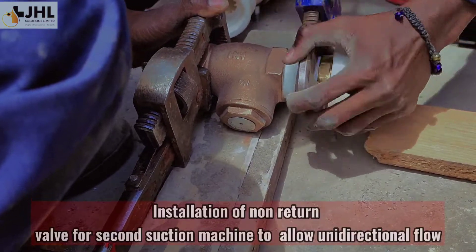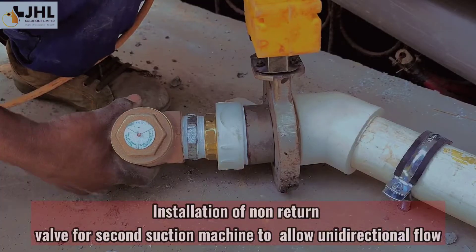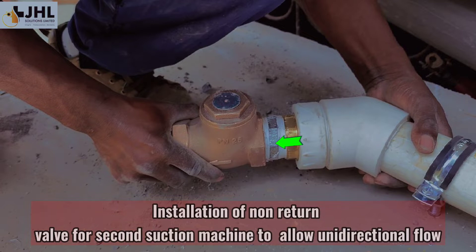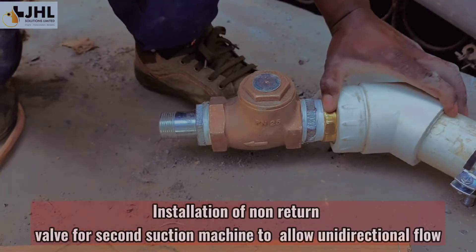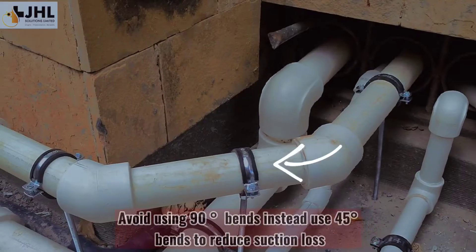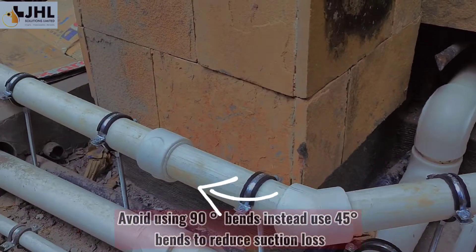Installation of non-return valve for the second suction machine to allow unidirectional flow. Avoid using 90-degree bends — instead, use 45-degree bends to reduce suction loss.